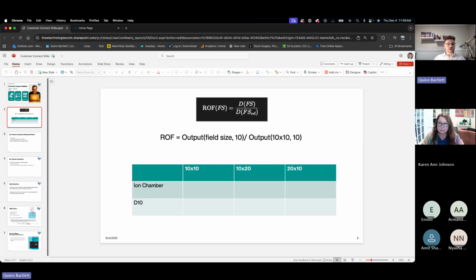And it's very important, because understanding ROFs can be a little complicated. We can help diminish common learning mistakes like assuming linear ROF changes, and help students understand things like the jaw exchange effect. Before, ROFs were very, very difficult to teach because they take so long to set up, and you have to be changing your field size and your jaws all the time. It just took a long time to get through that setup, and it was very easy to make mistakes as well.